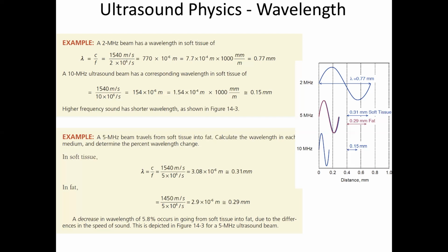However, we're way above that with this. We're up in the megahertz. A 1 megahertz sound wave is kind of an interesting thing. Is it sound anymore? Yes, it is. It's a pressure wave. And 5, 10 megahertz, and some of these systems go up to 30 megahertz.